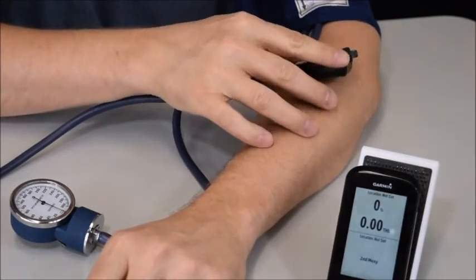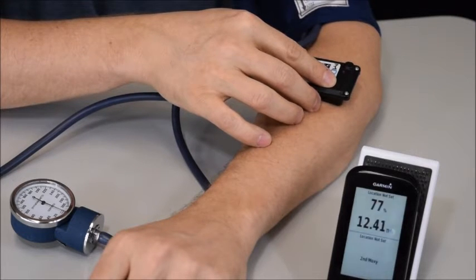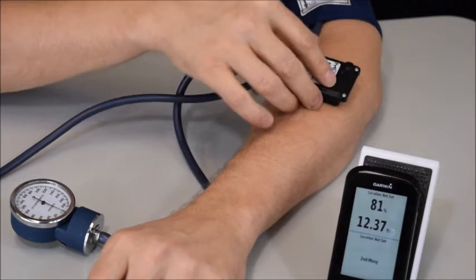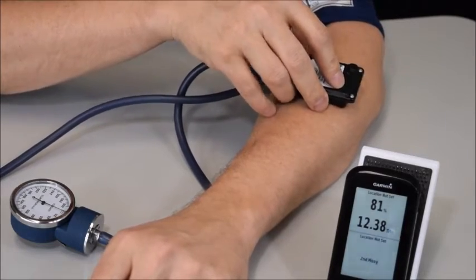Measure on the forearm, and this is going to measure a number as expected in the low 80s here, 80 or maybe upper 70s. So this is what we would typically expect to measure on a forearm at rest. Just a bit higher than the competitive device, but not really substantially different.